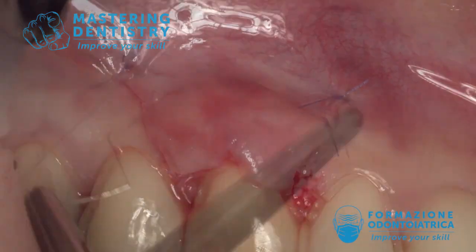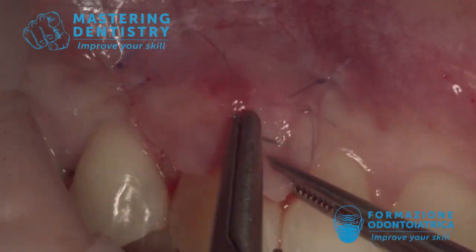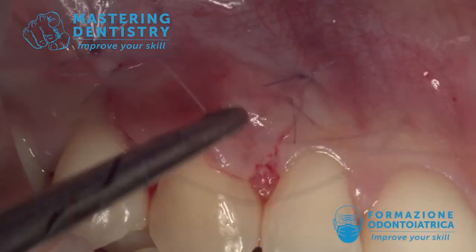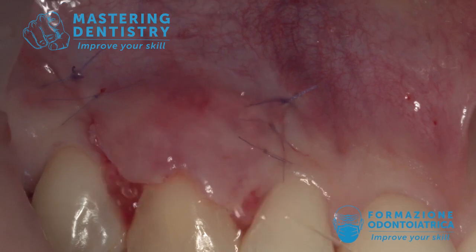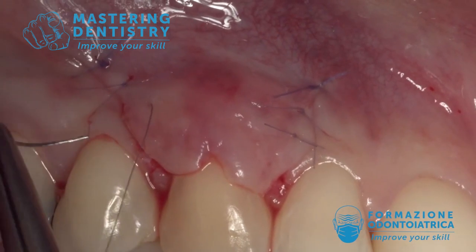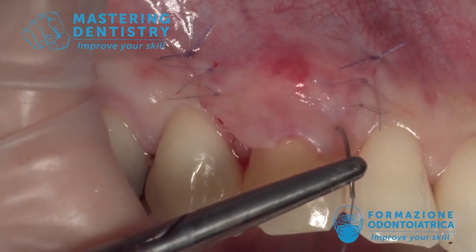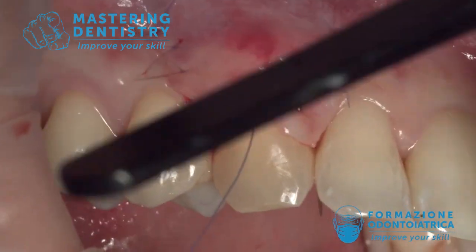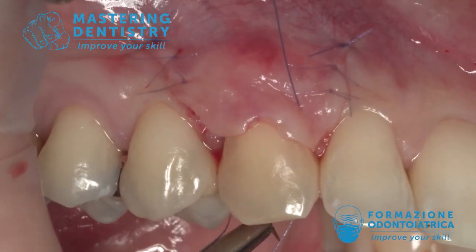Continue all along the vertical incision — you can go very close to the gingival margin of the other teeth because the flap is completely tension-free. All the tension has been broken and eliminated by the first two sutures. These very slim 7-0 sutures are all tension-free. Also the sling suture is tension-free; you may notice the flap is already in its final position without the sling suture — you need the sling suture only to close the flap and push the surgical papilla over the anatomical papilla.